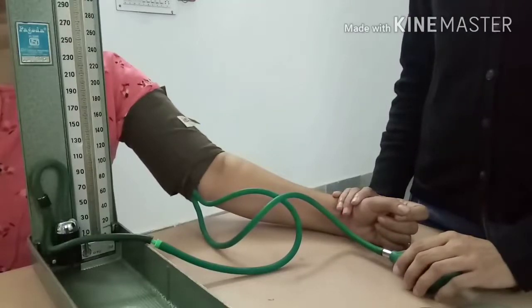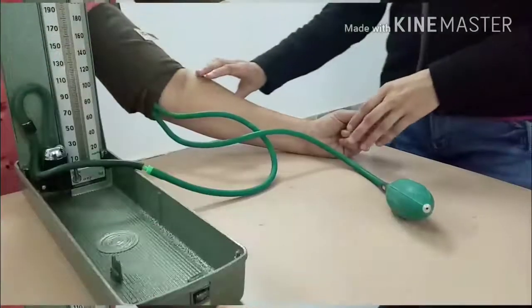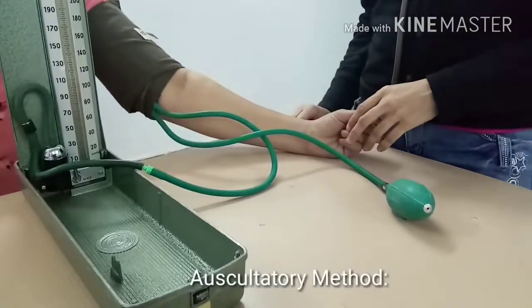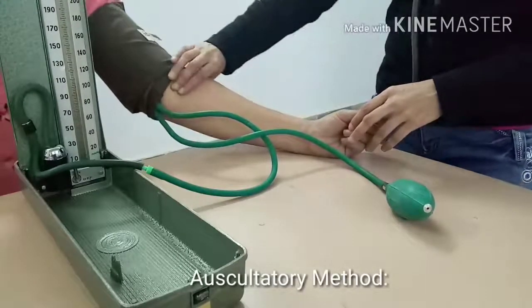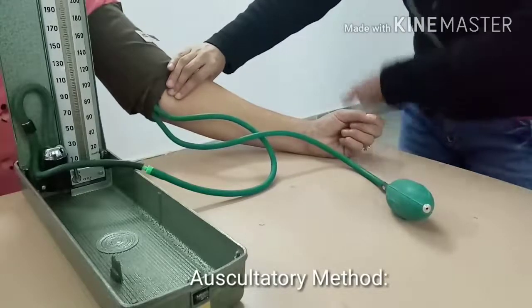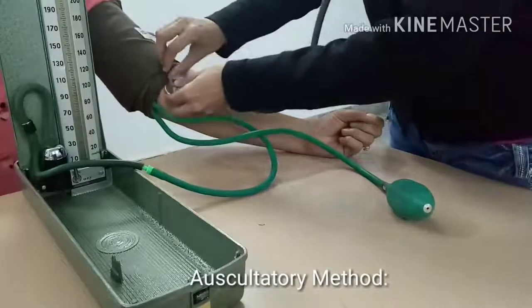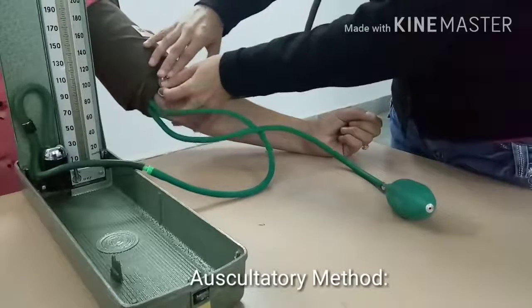Next is the auscultatory method. Apply the stethoscope lightly over the brachial artery located by palpation.